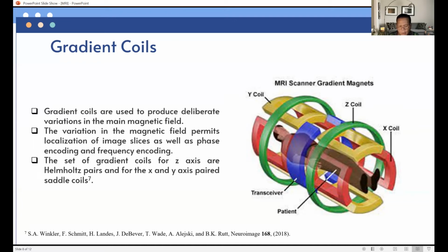A saddle-shaped coil is one of the several basic RF coils used in magnetic resonance instruments. The magnetic field of a saddle-shaped coil was calculated using the Biot-Savart law and numerically computed. The magnetic field of a sample coil was measured using a magnetic resonance method.